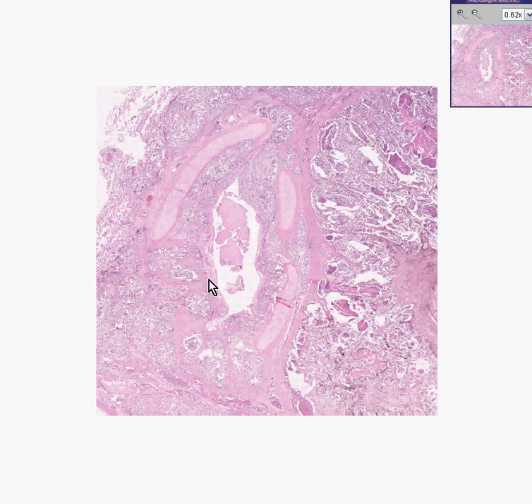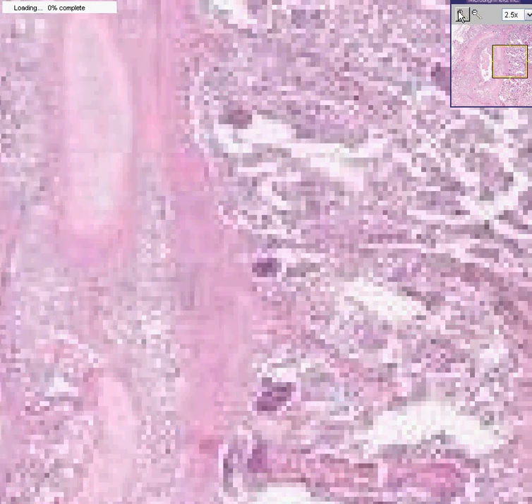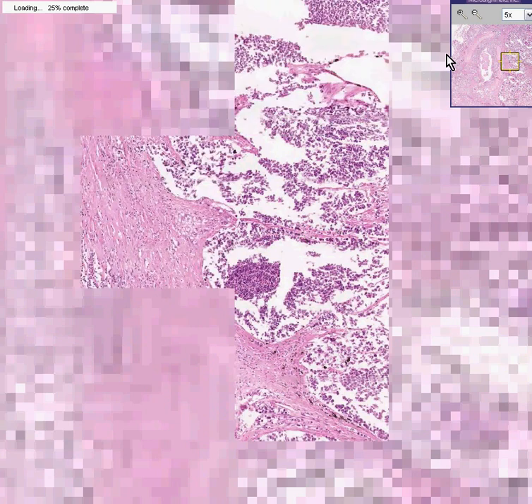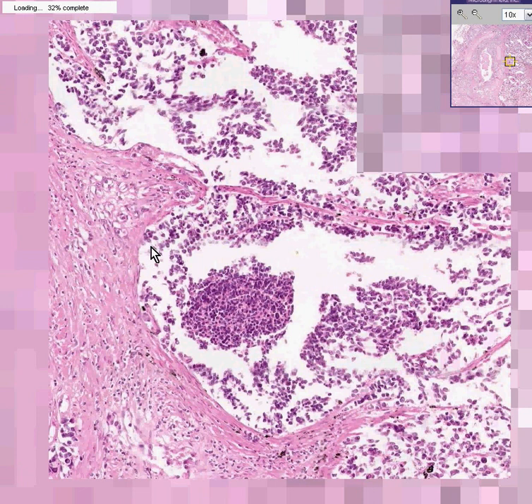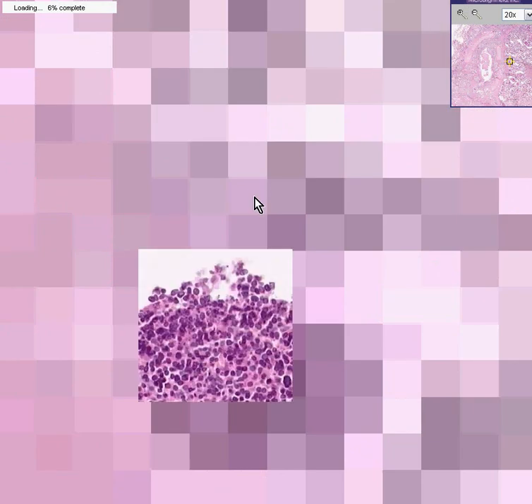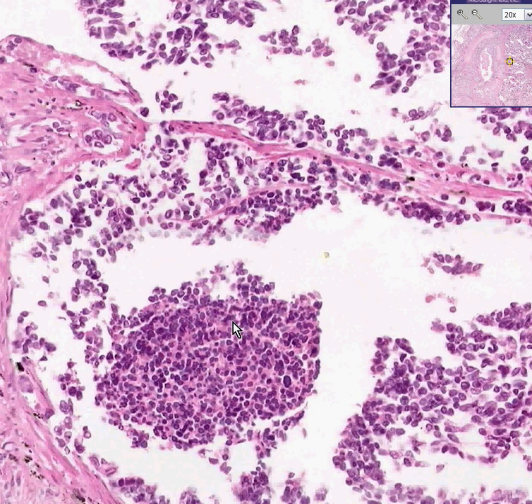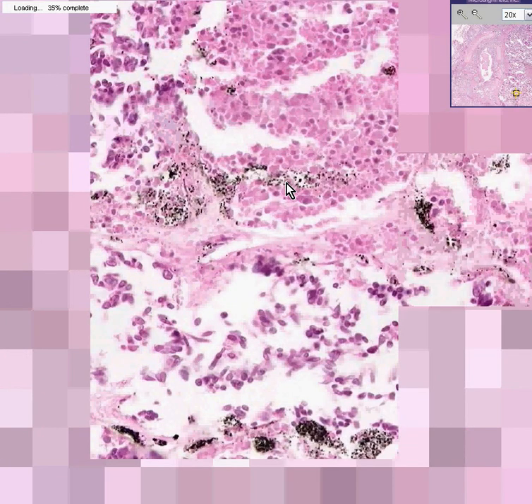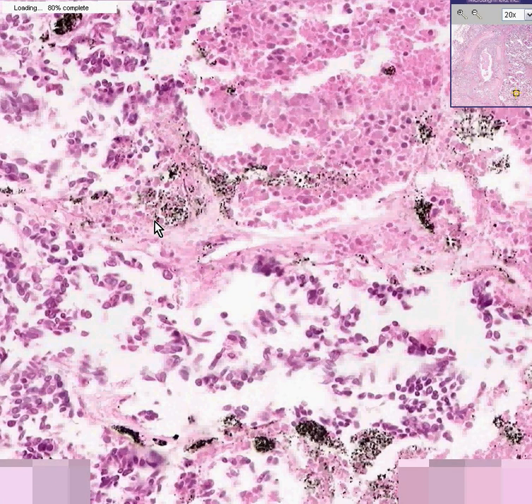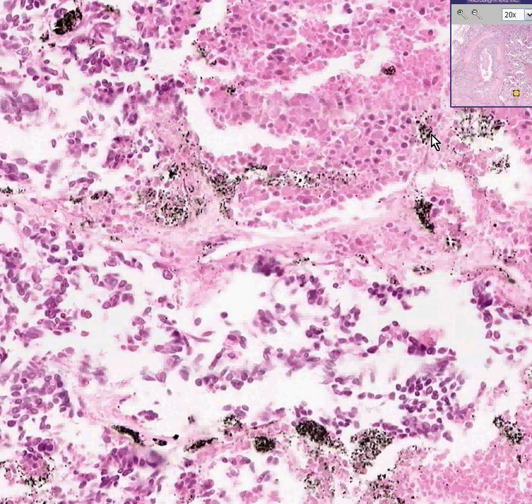What would you like to blow up first? Let's take this area — we'll center it, we'll blow it up, and we'll see something which by now should be quite obvious to you. We could see diffusely infiltrative tumor cells. These cells do not have any semblance of looking like they want to make glands. We see no evidence whatsoever for keratinization or spindly squamous type cells. This is another classical oat cell, in which you have small tumor cells with minimal cytoplasm. That's why they look so blue and they look so lymphoid. Probably these represent little anthracotic pigments within macrophages. It's obvious that these are tumor cells.